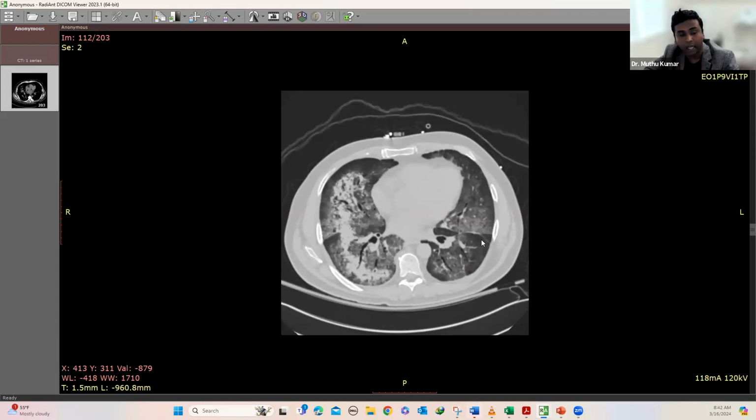And when we went back and asked the patient, she had occasional bouts of hemoptysis when she is doing trekking or hiking. So this implies that the patient has repeated episodes of hemorrhage, and this is indeed a diffuse alveolar hemorrhage. And when we checked, her renal profile was also altered, and the patient has had a history of chronic recurrent kidney infections as per the chart. So when we did an ultrasound, we found that the renal echogenicity was also increased. So all of this combined together, this is a case of pulmonary renal syndrome.